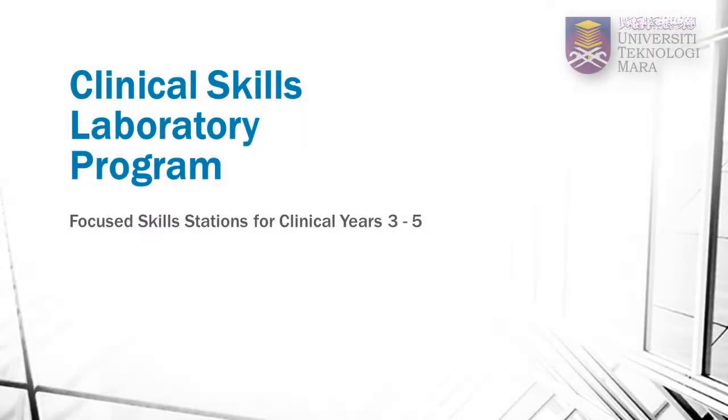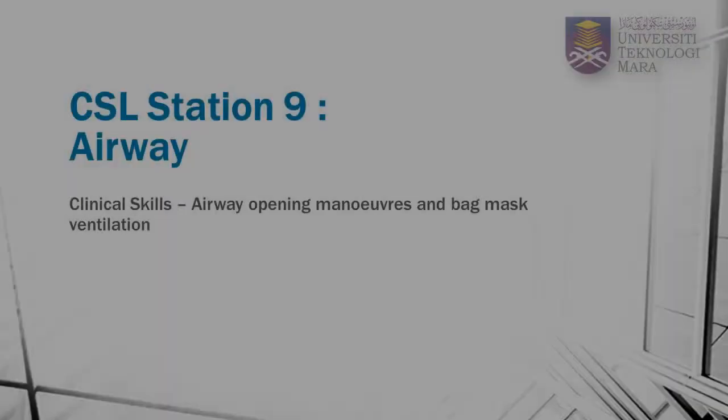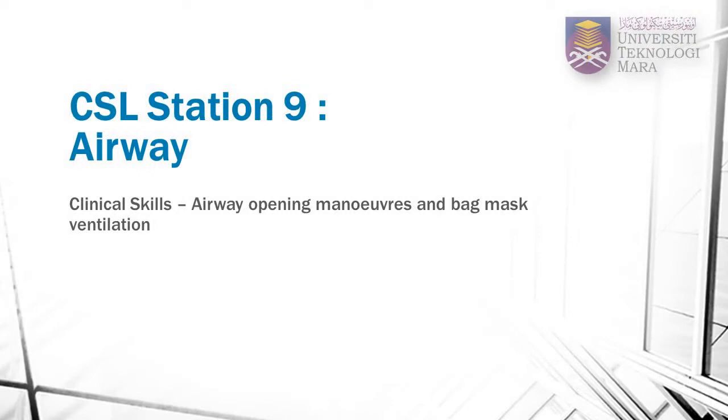Welcome to UITM Clinical Skills Program. This is Clinical Station 9, Airway Management. In this video on airway management, you will learn how to perform airway opening maneuvers, as well as the correct method of performing bag and mask ventilation.